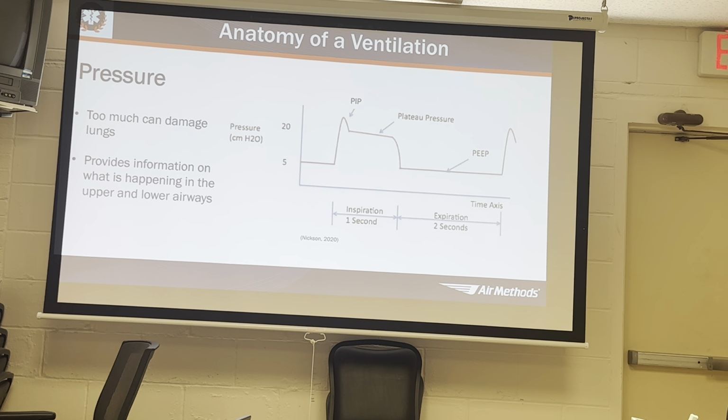This is basically what you would see on a ventilator. So this person's got a PEEP of 5. Physiologically, we have about a PEEP of 3, just sitting here chilling. We all maintain about a PEEP of 3, so we don't ever want to go less than 3. Generally, we'll set them at 5. So the PEEP is at 5. That's our constant on the bottom there.